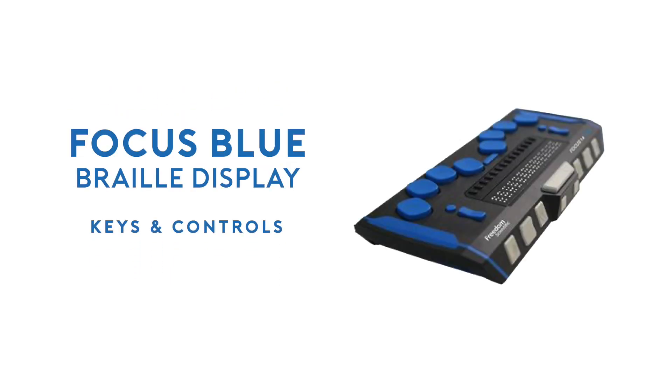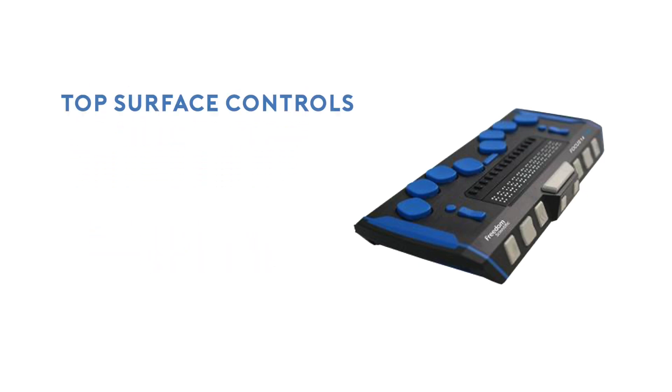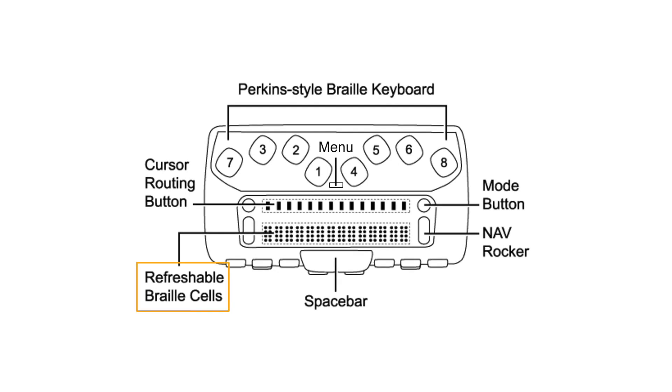We are going to briefly discuss the keys and controls you will find on the Focus Blue 5th generation Braille display. We'll begin by exploring the top surface of your Focus Blue. The refreshable Braille cells are located at the front of the unit. You will feel a line of Braille cells with the pins slightly raised.